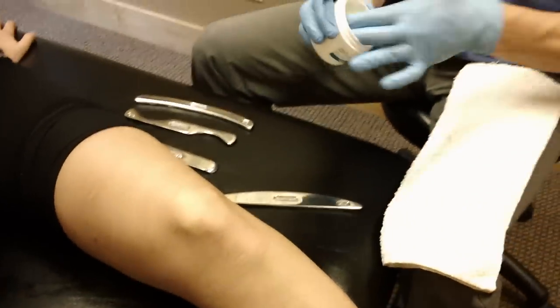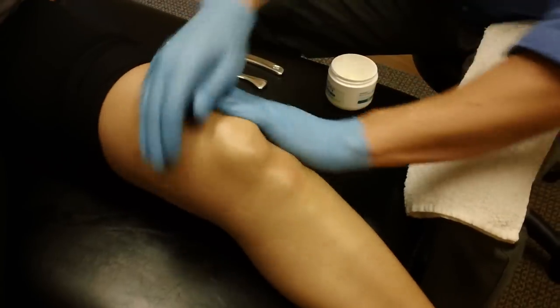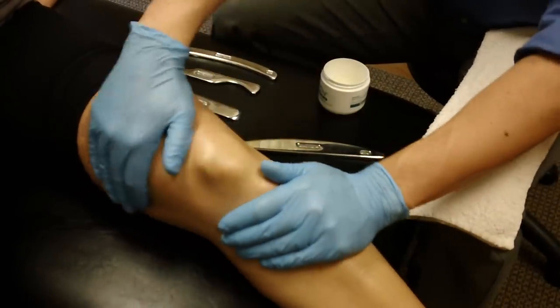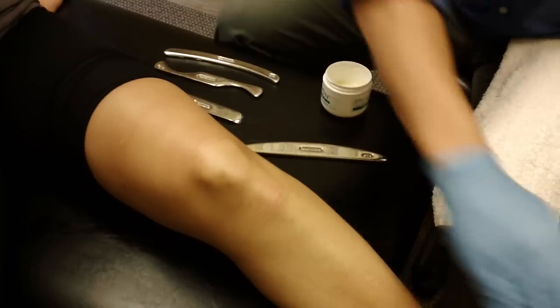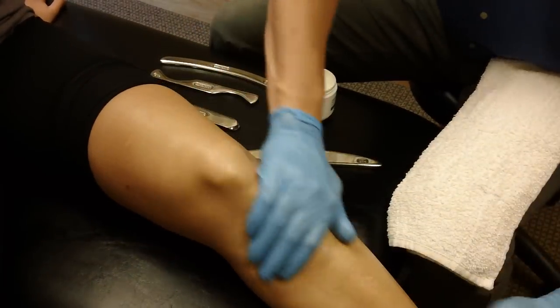The first thing we want to do with the Graston Technique is reduce the friction on the skin surface. So we want to put some emollient on the area that we're going to treat. You can use a number of different things for this — regular lotion, BioFreeze, mineral oil. Graston Technique makes its own emollient and that works really well, and that's what I like to use.